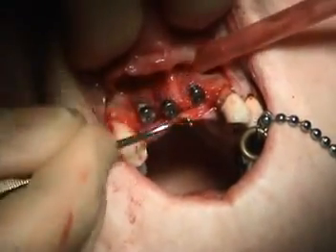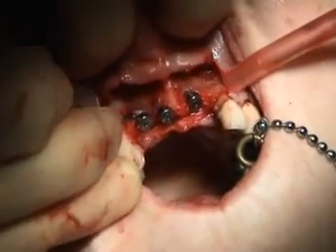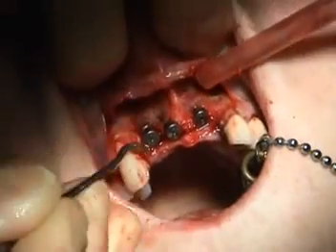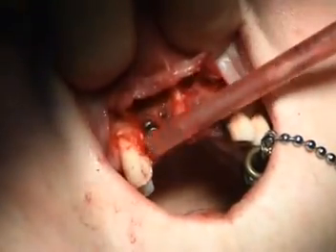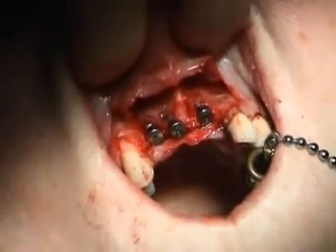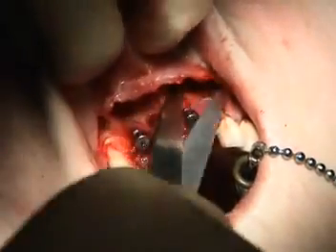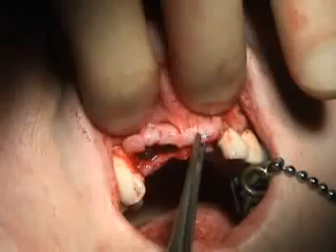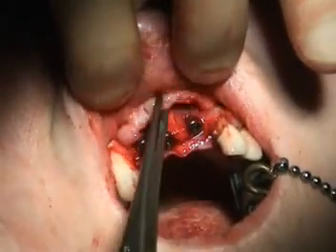The area to receive the bone augmentation is carefully checked for residual soft tissue tags, and also the underlying residual bone is roughened to produce bleeding points. This will facilitate angiogenesis into the newly placed bone augmentation. The flap is also undermined to allow for a passive closure of the flap over the bone augmentation once it is completed.